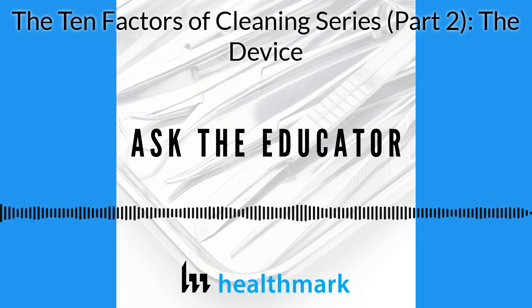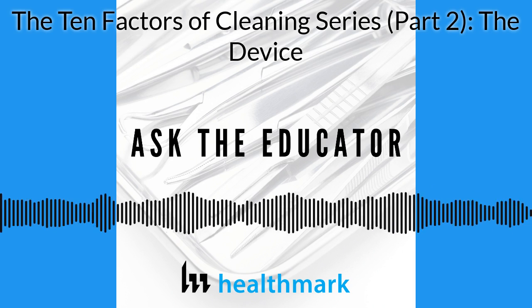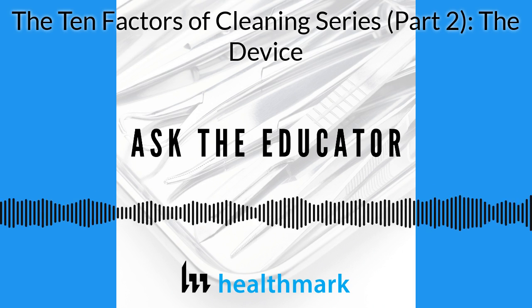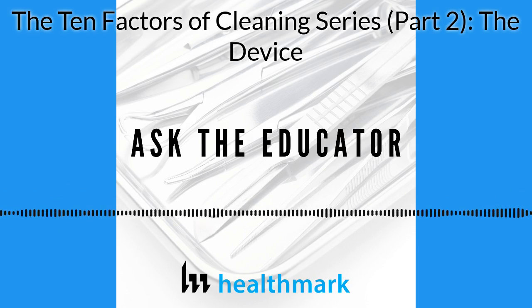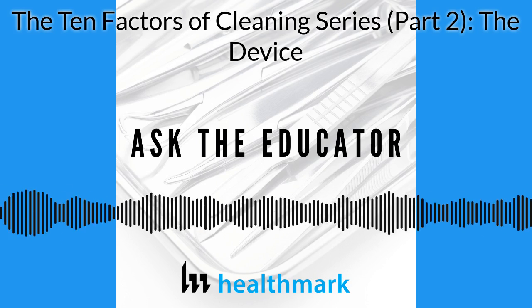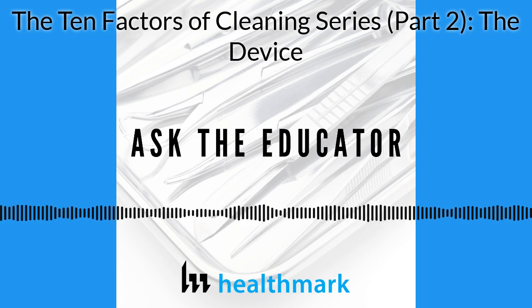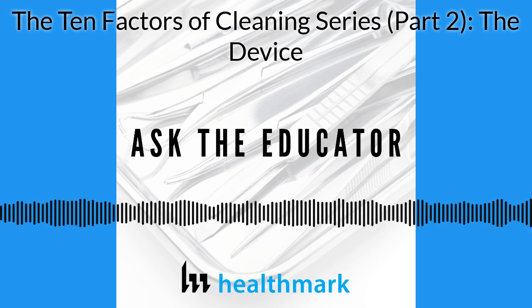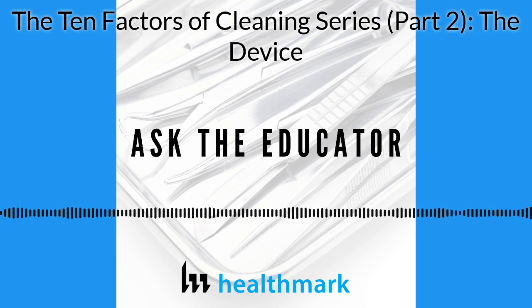Sure enough, we still had people put them in the trays totally taken apart, and then the OR would get them and be like, what am I supposed to do with this? The scrub tech's like, I don't even have a clue how to put this thing back together. And they are a little bit tricky, some of them. You can see how the pieces go together, but they still have to click in place in a certain order to actually function. So all of those factors do come together, but that complexity of the device, those 3 different levels that we talked about, I think are a great way to think about them all. And that helps you when you're deciding what to buy and how to train. That's how these things all come into play.